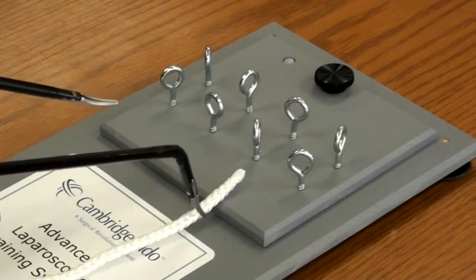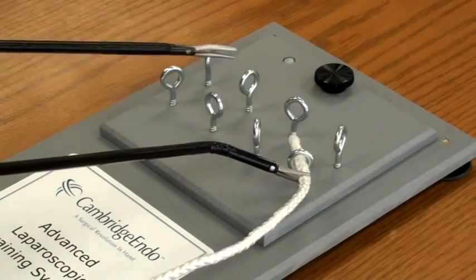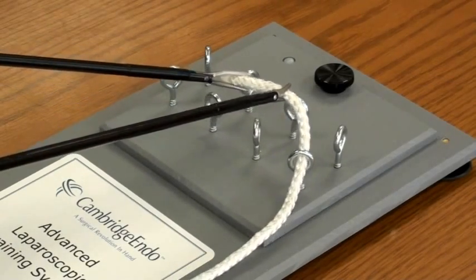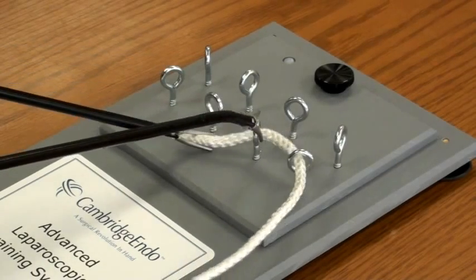With the autonomy dissector or grasper and a rigid assist device, practice threading the rope through the eyelets. Notice the eyelets are in random angles. Utilize autonomy's wrist articulation to achieve the optimal approach angle.